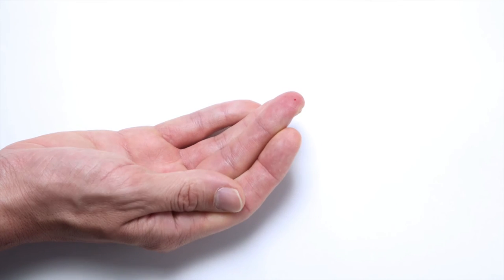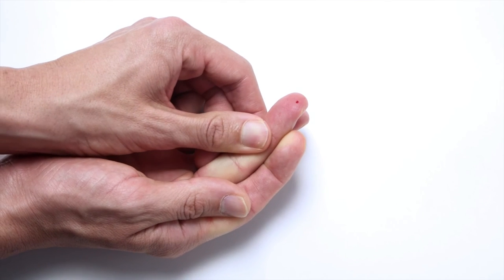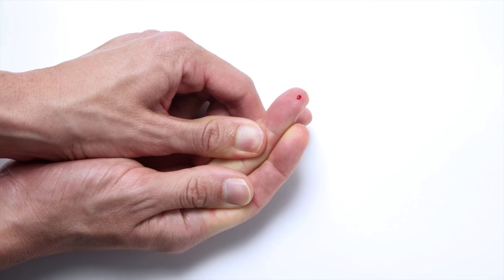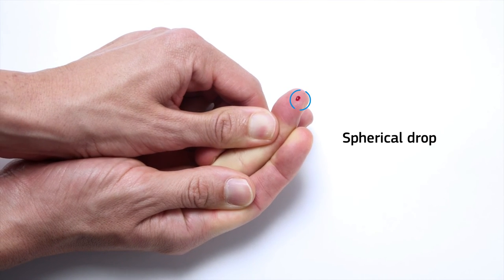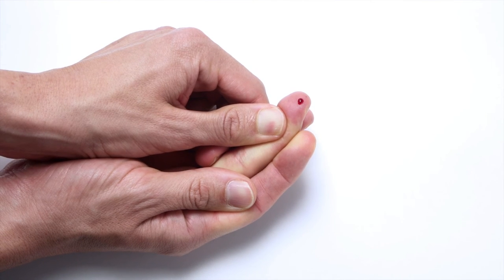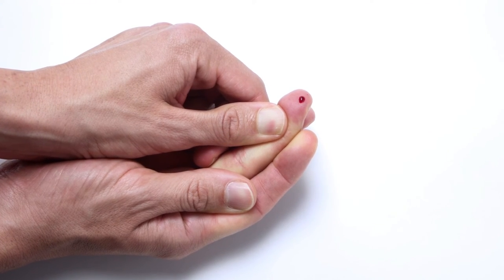Place the lancet firmly against the fingertip and activate it. Massage the finger to bring blood to the fingertip and gently press to help form a drop of blood. Make sure to obtain a spherical and properly sized drop equivalent to a teardrop. Do not press the finger stick site or let the drop of blood spread on the finger.